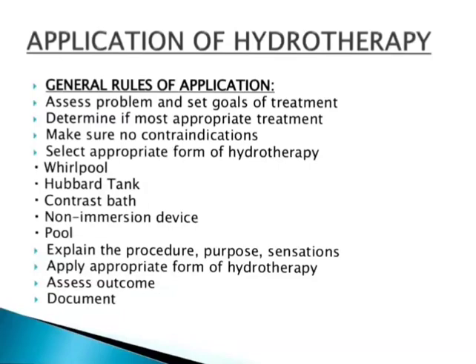Everyone, today's video is on hydrotherapy equipments. In previous videos we have discussed the principles, indications, and contraindications. In this video we'll be discussing the various equipments available for hydrotherapy.